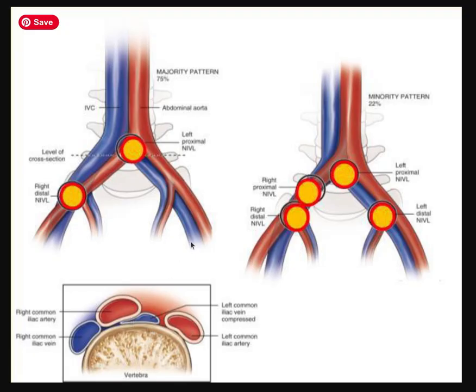In looking at people who have May-Thurner syndrome, the most common pattern involves these two compressions. A few select people are unlucky enough to have all of the compressions. I actually had three out of the four — this compression, this compression, and another further down on the left side — and those were fixed with one long stent on the left side.